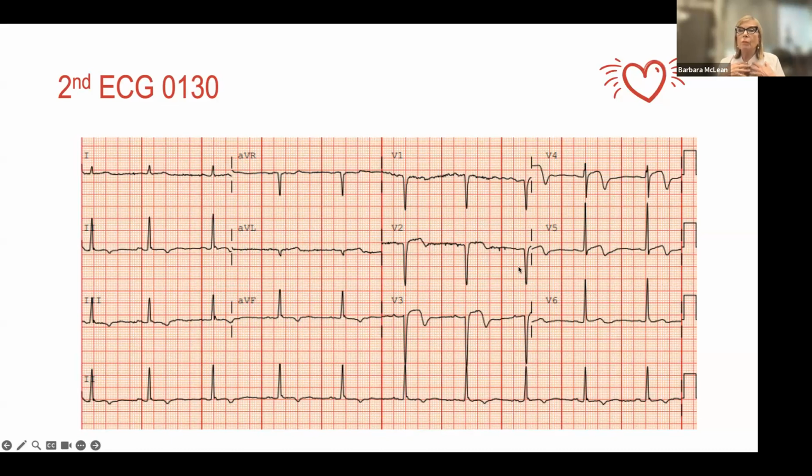The other thing we look at when we look at EKG is what we call R-wave progression, assuming either a smaller or no R in V1, a little bigger in V2, bigger yet in V3, bigger in V4, big in V5, and a little smaller in V6. That's what we call normal R wave progression. Your patient has poor R wave progression. So that's also a really important signal here.